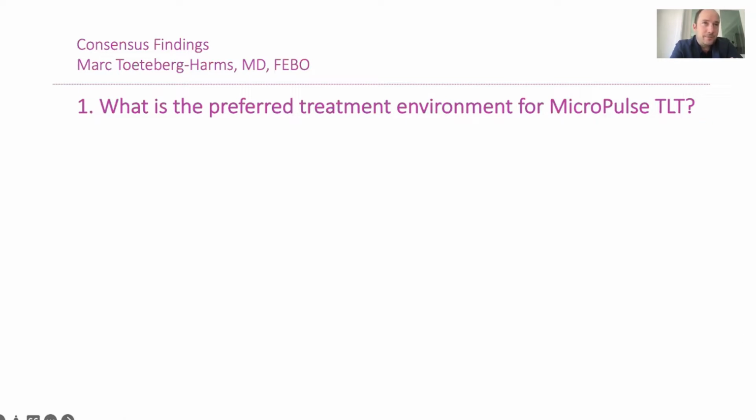The MicroPulse divides the laser into off periods and on periods, but also from a technical standpoint, we are not doing discrete spots with the traditional MicroPulse technique nowadays, as we used to do with conventional cyclophotocoagulation. When you are sweeping around the eye and moving the probe, you have to keep that in mind to be able to calculate the amount of energy that you're delivering. Fluence, a term that comes from physics, incorporates that variable much better, which we were neglecting to some extent.